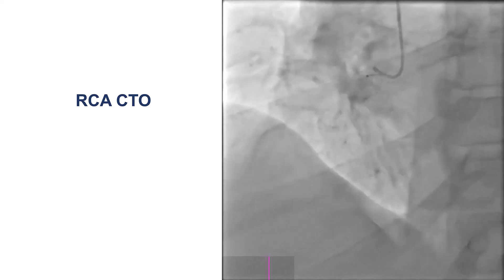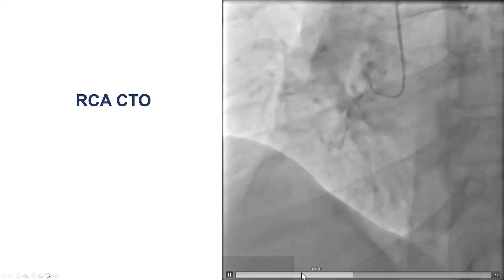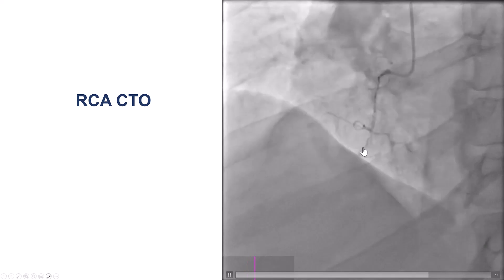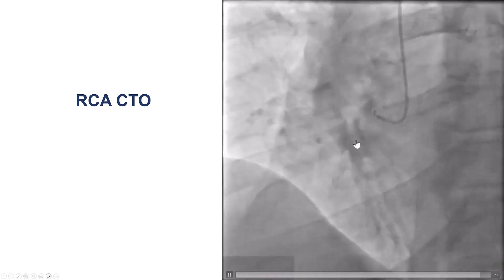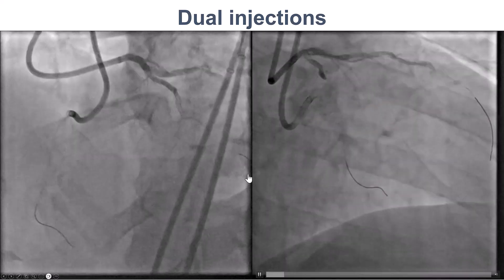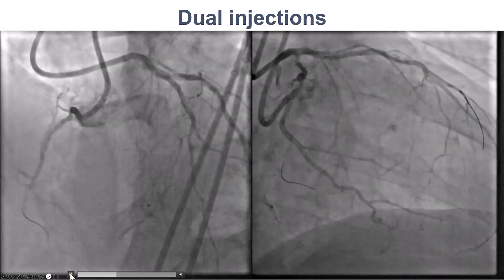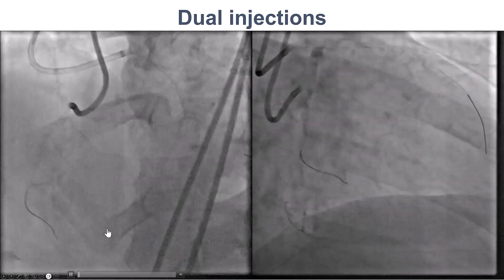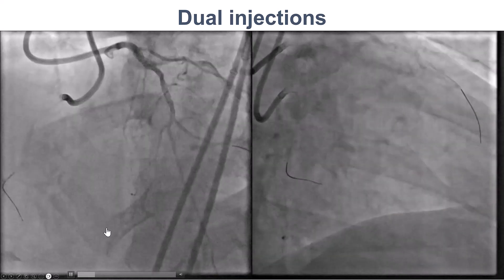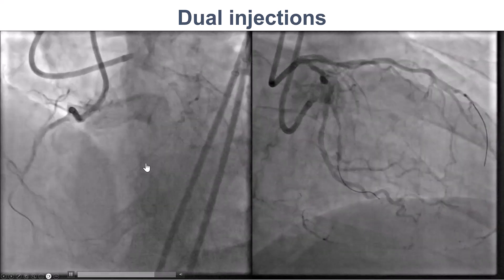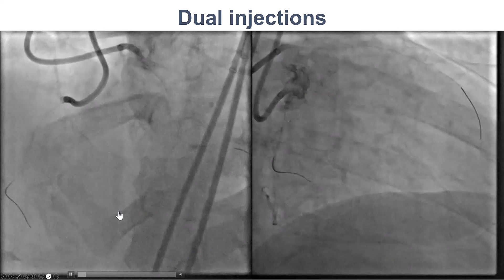The patient was referred for PCI of a right coronary artery CTO. He had a well-defined blunt proximal cap and a small acute marginal originating above the area of the CTO. On dual injection, there was again the well-defined proximal cap, diffusely diseased distal vessels, and there seemed to be some septal as well as some epicardial collaterals going to the distal right.